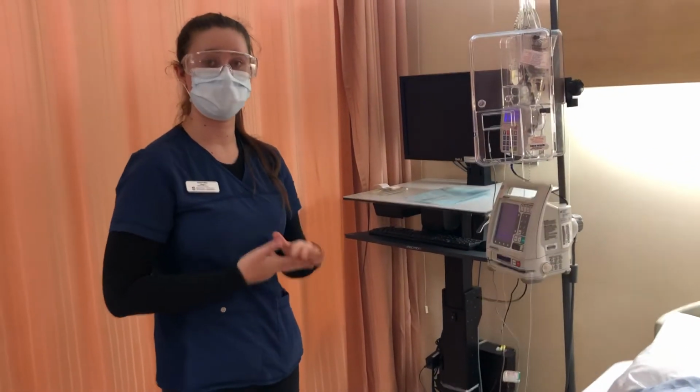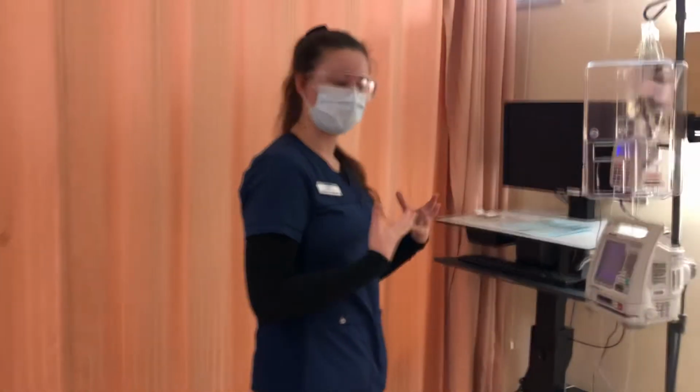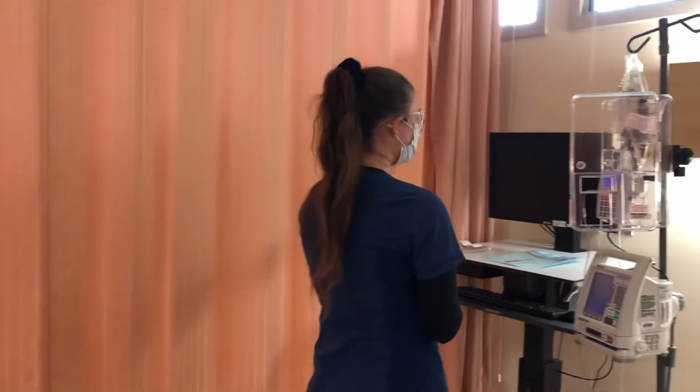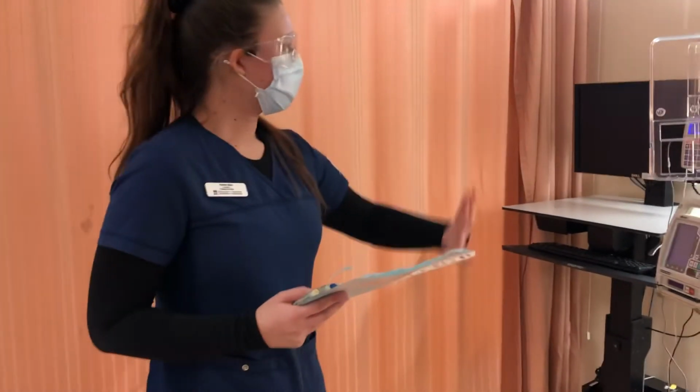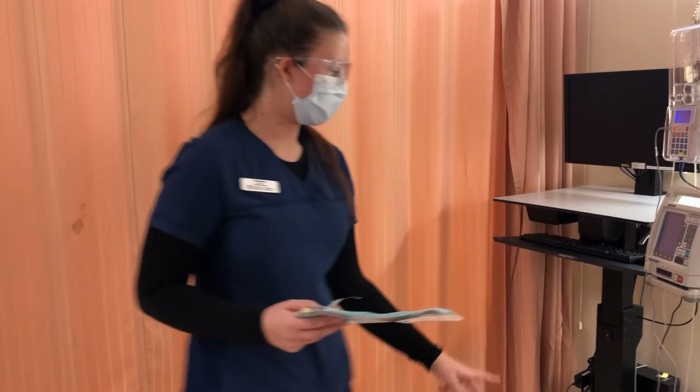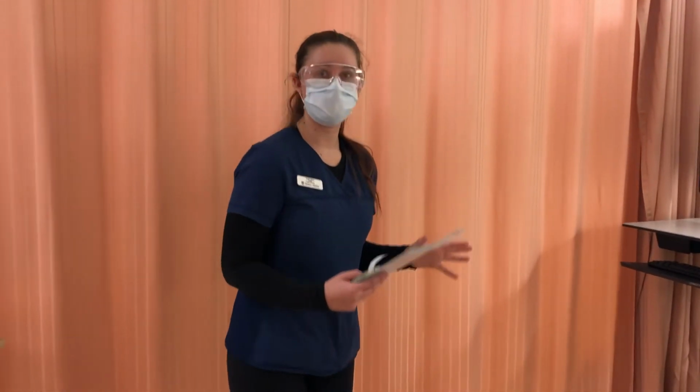The patient knows that I'll be back very frequently to assess their vitals, mental, and respiratory status, and they know which symptoms to look out for in the case of a reaction to the medication. So I'll be removing the medication to waste. The button's in reach, the pump is locked, all of the clamps are open, the green light is flashing, call bell's in reach. There's no hazards in the room, so I'm leaving to document.